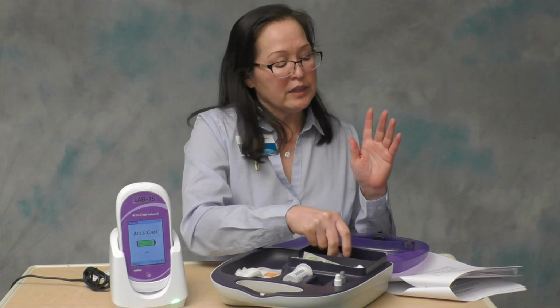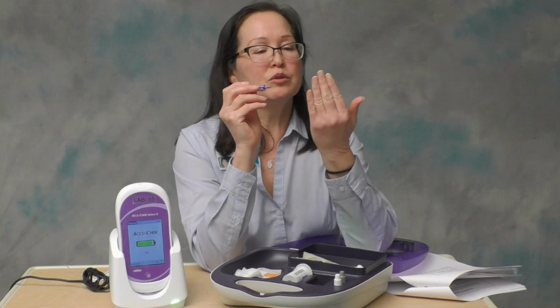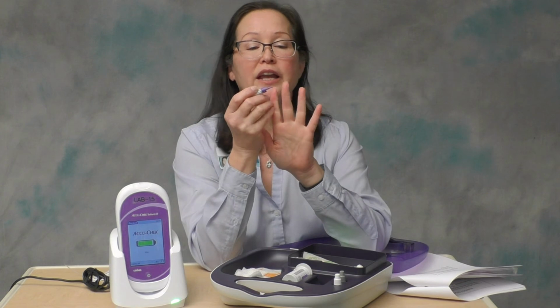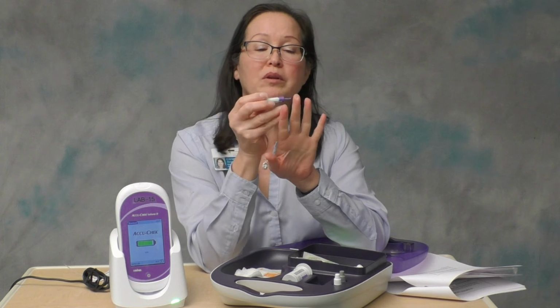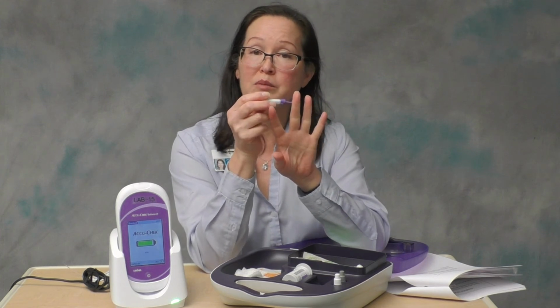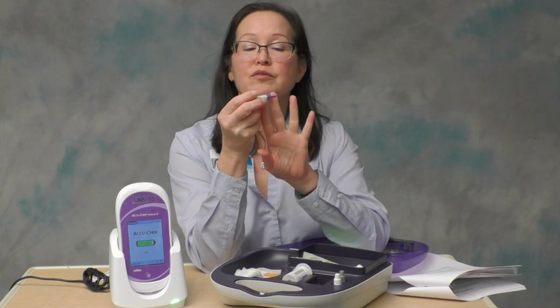And then you're going to lance the patient on either the right or left curvature of the finger. I always train to face the finger, draw an imaginary clock face on it, and at either 10 or 2, just like you're supposed to put your hands on the steering wheel, that's where you're going to do your lancing. You don't want to lance in the center of the pad. You do not want to lance on the side of the finger, and never ever down near the joint where the ligaments and nerves run just under the skin. So the greater curvature of the finger.